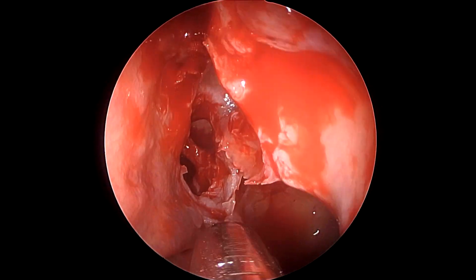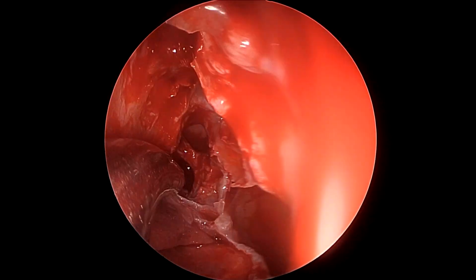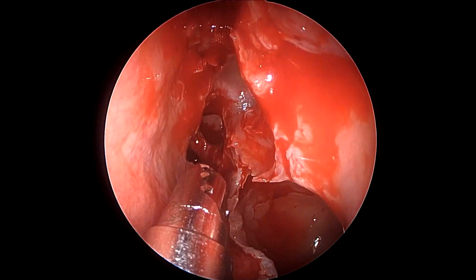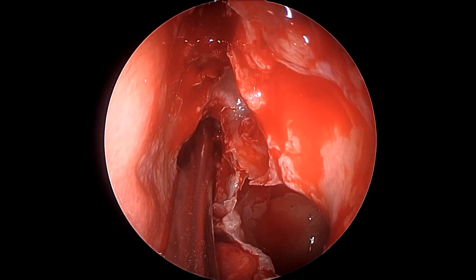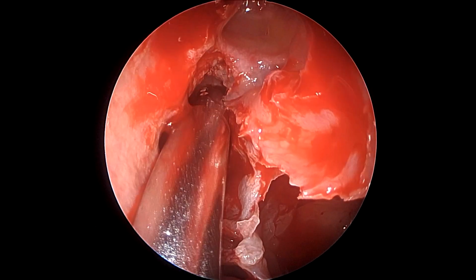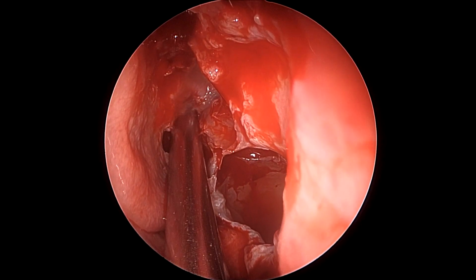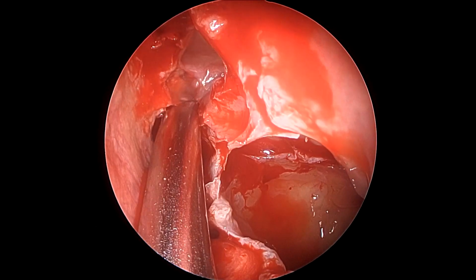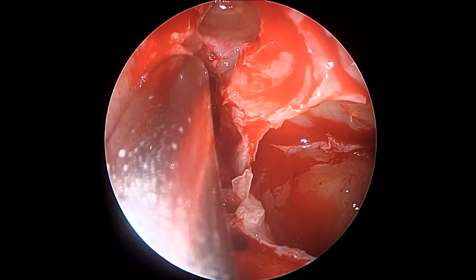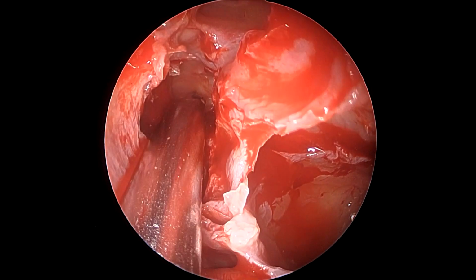In this patient as well, the deviated septum will be dealt with after completion of sinus surgery, not because the surgery cannot be completed, it can be, but overall the obstruction would still remain, and the irrigation and the post-operative control in the office would be suboptimal in the absence of addressing the septum. So now we can use this 40-degree angled shaver blade in a guarded fashion to clear off the redundant mucosa and the excess cells in the ethmoidal complex, in the posterior ethmoids.